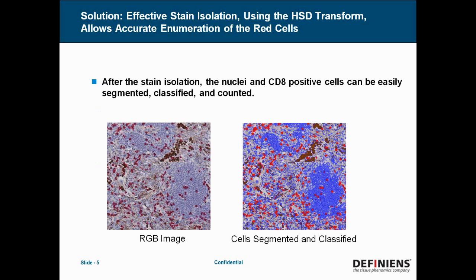After the stain isolation step, the nuclei and the CD8 positive cells can easily be segmented, classified, and counted. And that's shown here, where we have our original brightfield image, and then we have our overlay of our segmented and classified cells on the right.